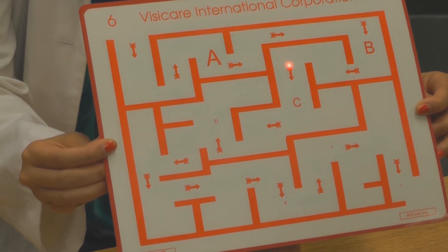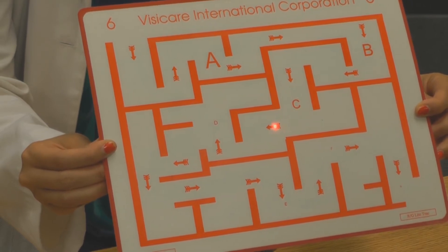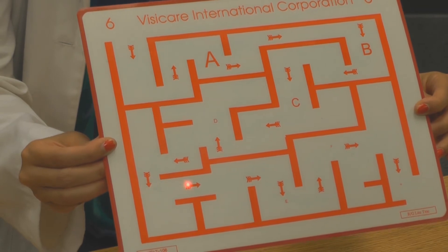If the patient has either an eso, exo, hyper, or hypo shift, the alignment of the light as it hits the objects would be either above, below, to the right, or to the left of the various objects.